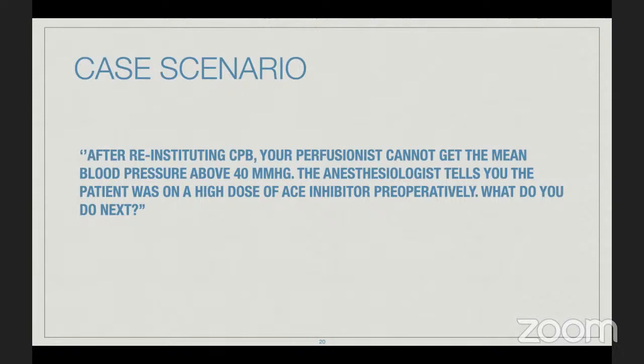Coronary blower, that's Dr. Farid. I mean, CO2, we use that all the time. I personally use it when I do the coronary artery bypass, but never seen any problem with it. But it might happen. This is something from outside, but everything is possible. But a significant amount of air has to be something that enters into the circuit, and most of the time it's coming from the perfusion side.